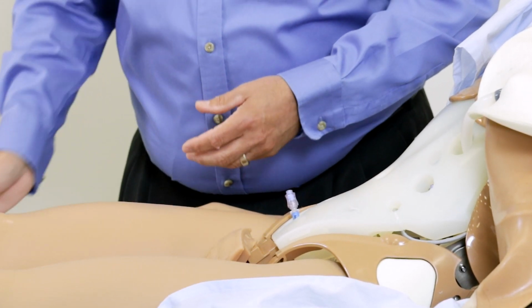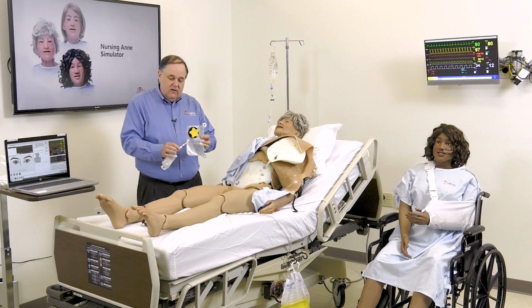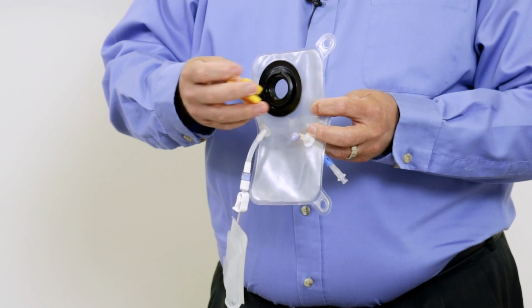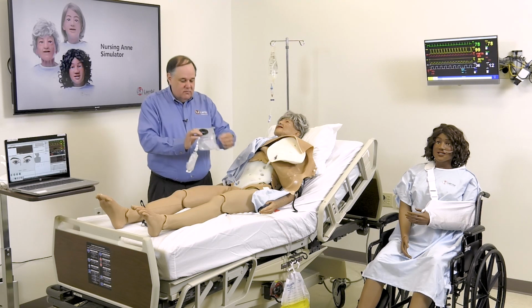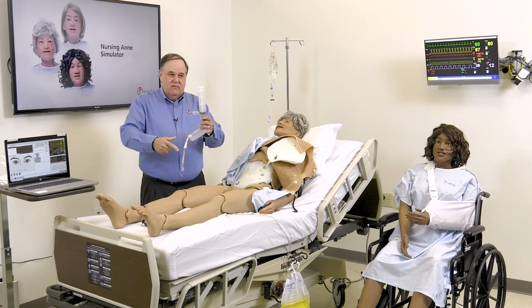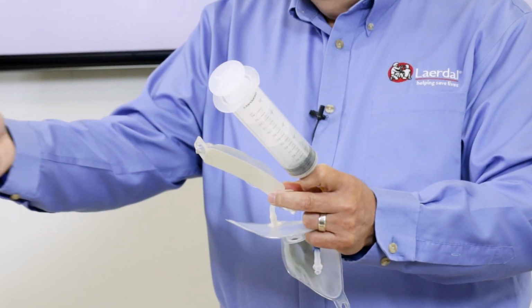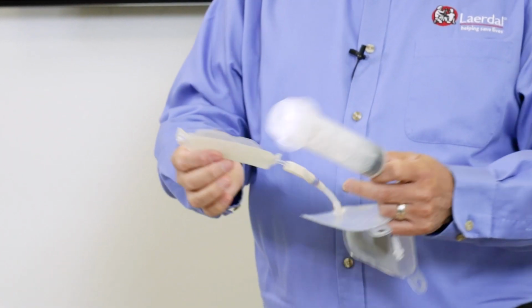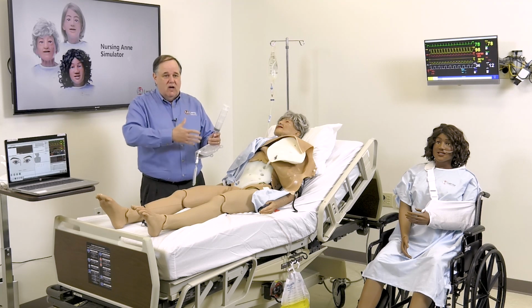When you push the fluid in, it goes into the appropriate reservoir bag, and we have those bags here. Here we see the urine one that's color-coded yellow, very appropriately. There's a color-coded red one, and you can imagine it's for the blood, and then a green one for the stomach. And these are the extension tubes that come up through the abdominal plate that we're connecting to, inserting the fluid in. Because it's her bladder, she does have a connection here that goes out, and when we catheterize her, this connects to her genitalia, and the balloon sits in here and fluid comes in. Each reservoir accepts approximately 500 mils of fluid and about 300 mils of air, and the air actually helps push the fluid out.